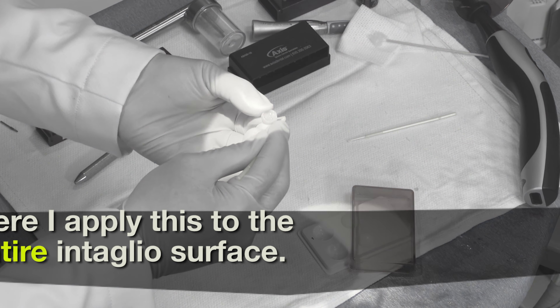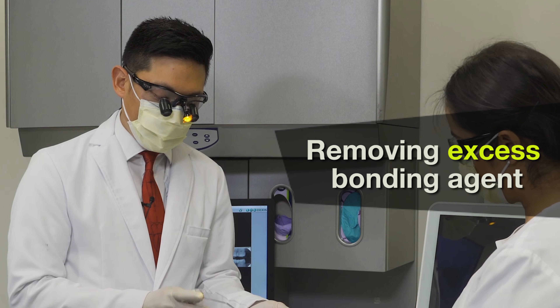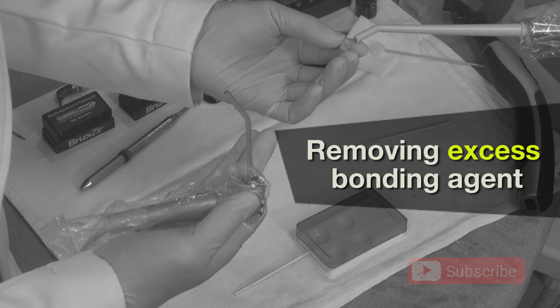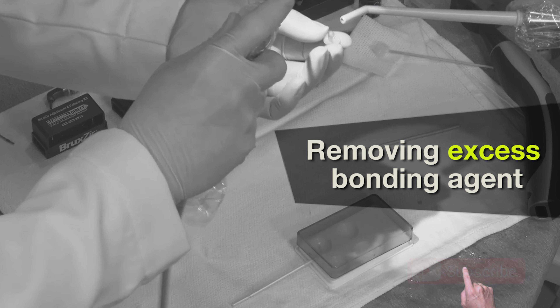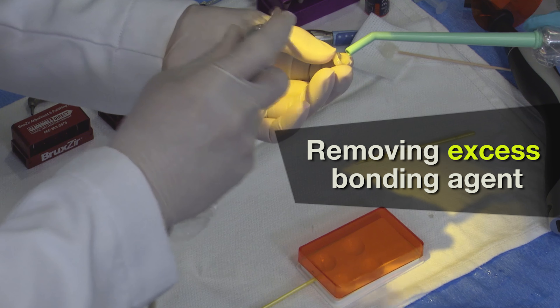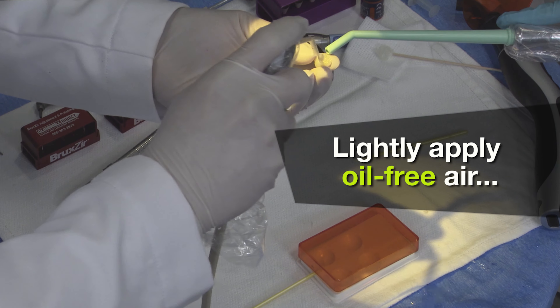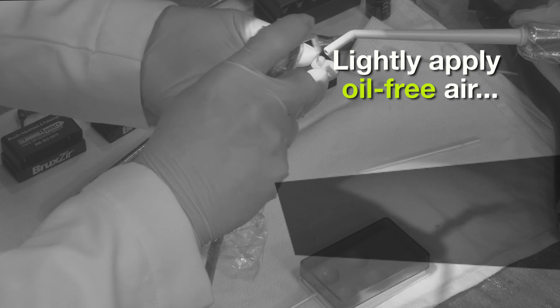Including the margins of the restoration. Something that we do is use suction to remove some of the excess bonding agent on the restoration. And also with oil and water-free air, we're going to lightly apply some air to this to continue thinning out the bonding agent.